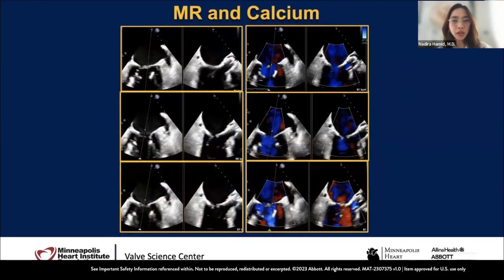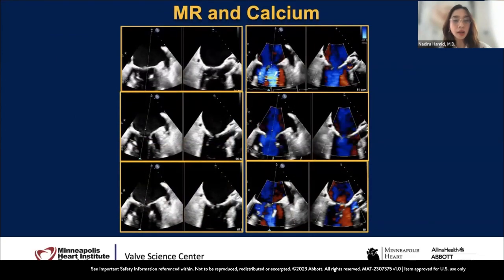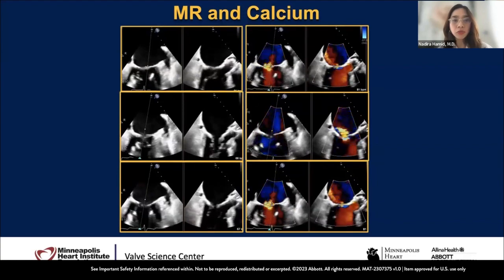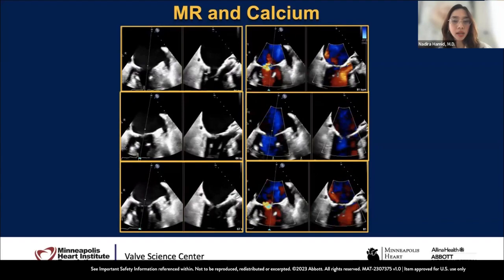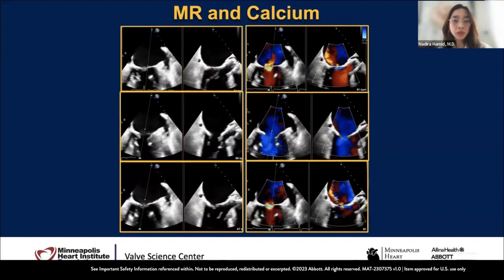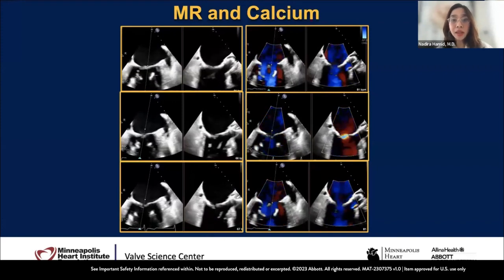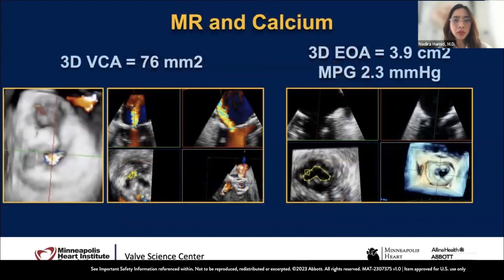But really talking about that pre-screening. So this patient had a pre-screening. I remember this case vividly, that it was on the table. So I took my time and really assessed this case. You can see, moving, like I showed you, that commissural view, from lateral to medial as well. Where exactly is the jet? And the majority of the jet, as you can see in the top row, the majority of the MR jet is central. It's still a little bit medial and lateral to A2, P2, but the majority of it, the PISA, is really central.